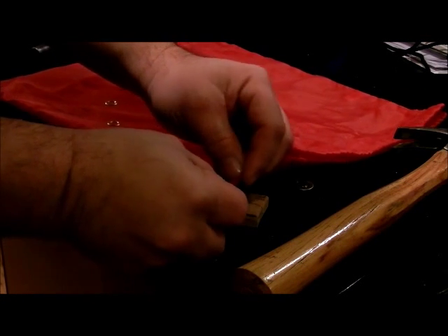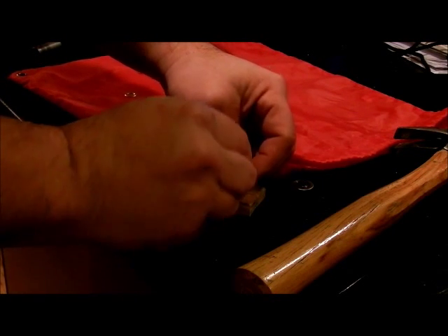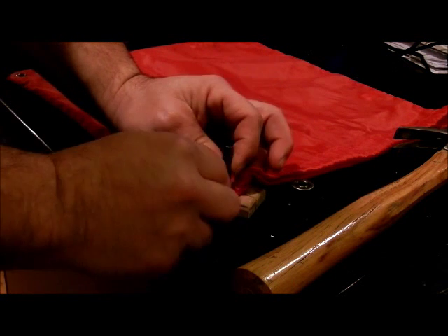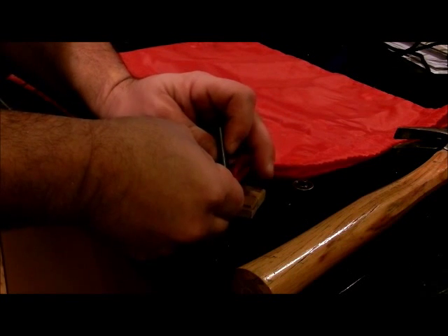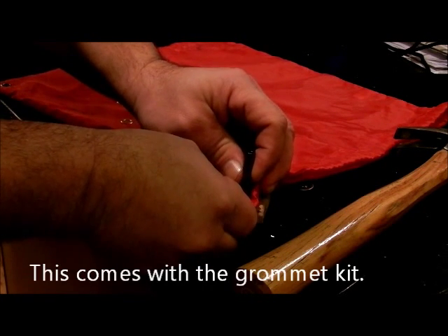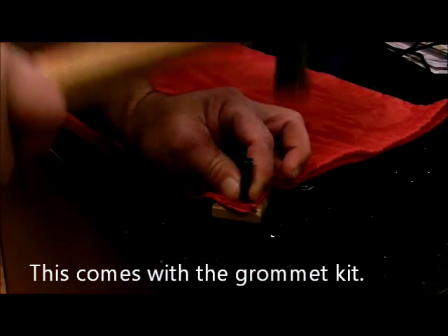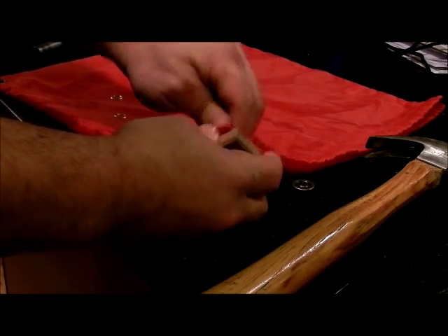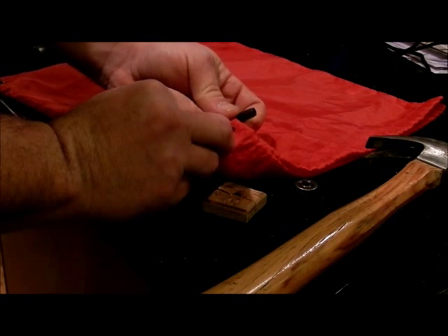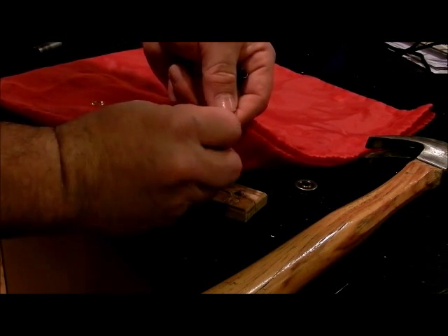We're going to go ahead and put our hole through. I've actually broken my wood base by hitting it too hard. So we're going to make it about even on both sides, and make sure we're good on both sides. Get it right on the corner, about even and centered. And we're going to get a couple of mounts. Now of course it's stuck to that, so we've got to break it free. And I think I went all the way through. I'm close to it.